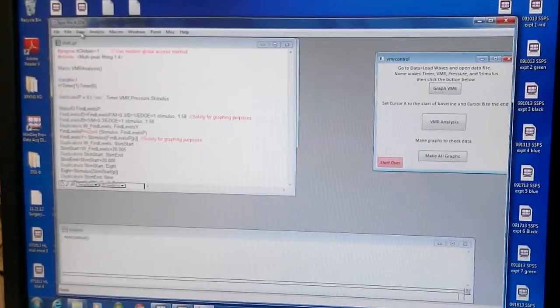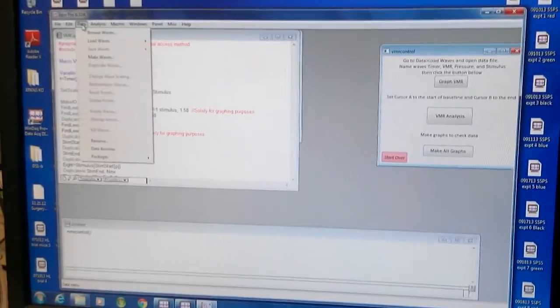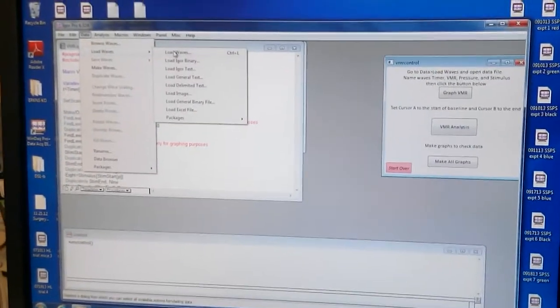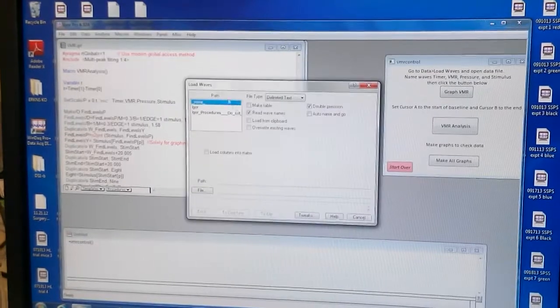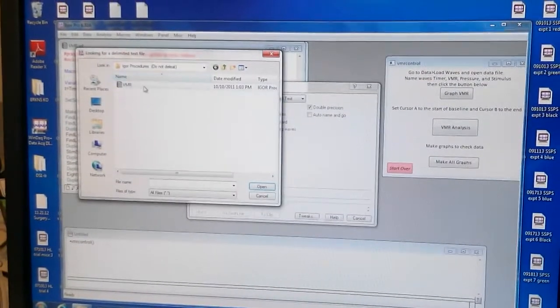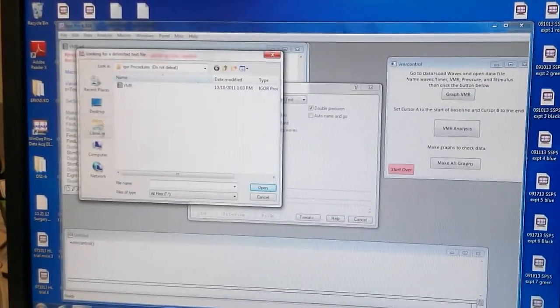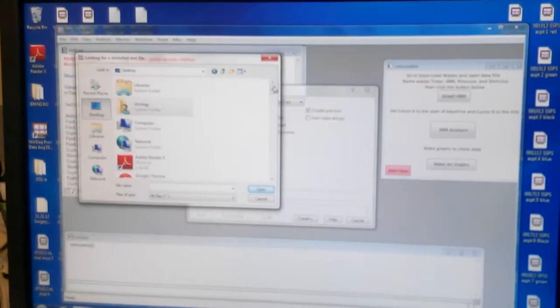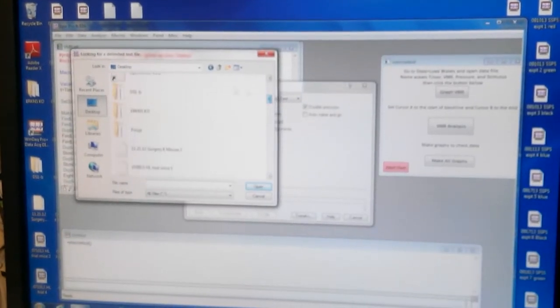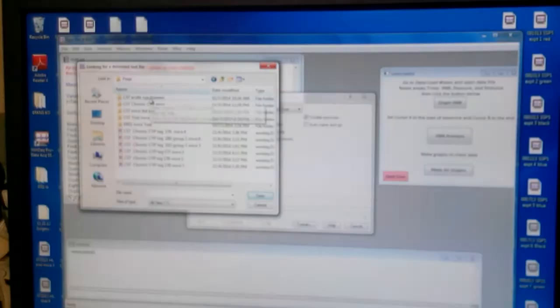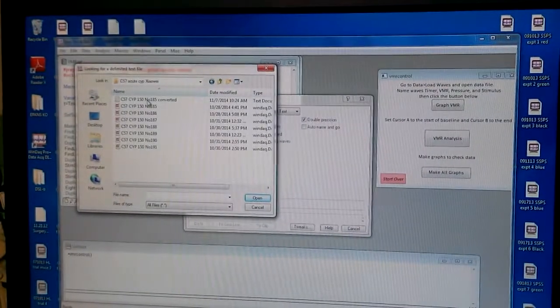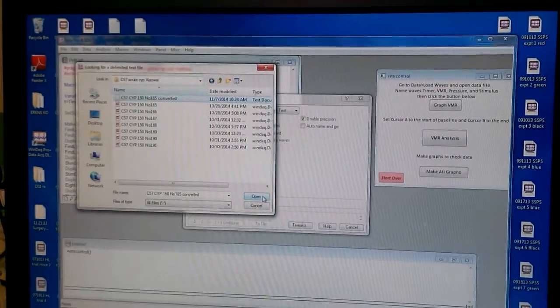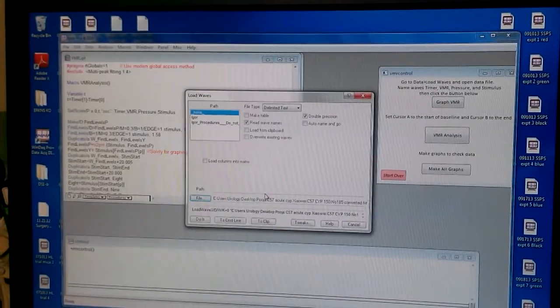Now you load your file. So you go to load waves, load waves. You open the file. You go to desktop, whatever your file is. This one. You click open.